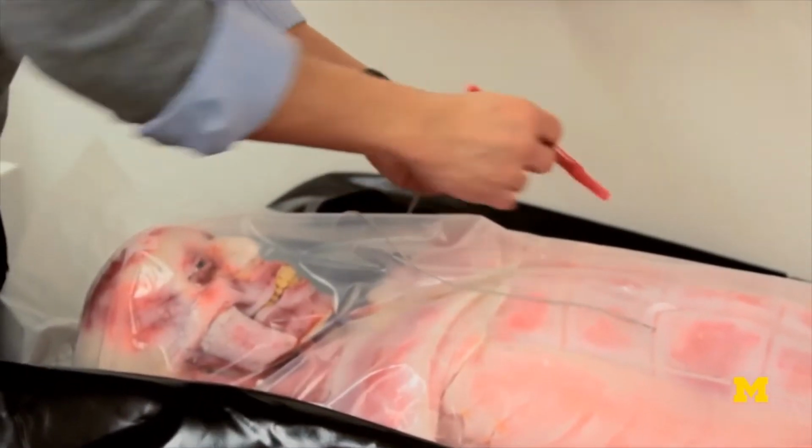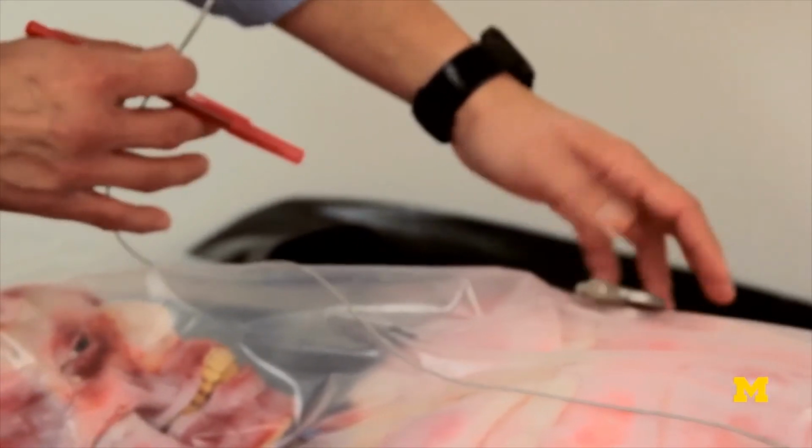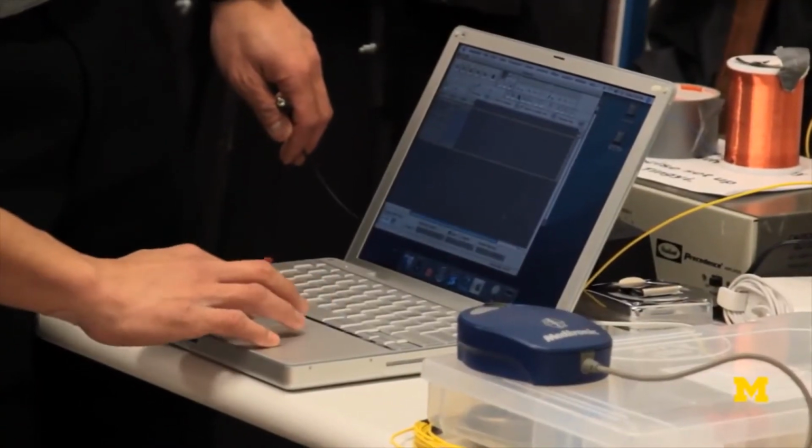Researchers have identified a new security risk in the sensors of medical devices such as implantable cardiac defibrillators and pacemakers. In my laboratory, we look at how to improve the security of devices ranging from RFID-enabled credit cards to implantable medical devices. This is a defibrillator that was explanted from a patient and was donated, and we use these devices to test how secure they are. And our research explores how to make sure that the wireless interface doesn't lead to a compromise of the system.